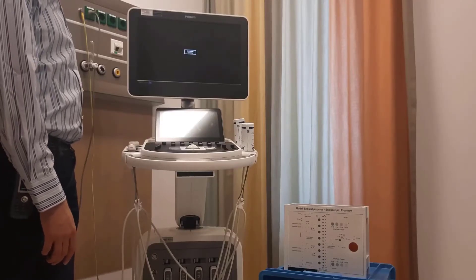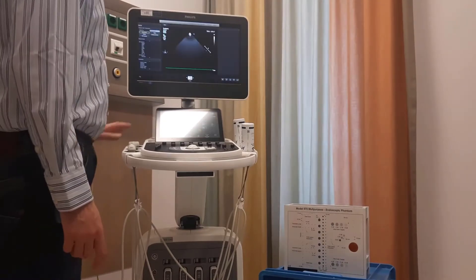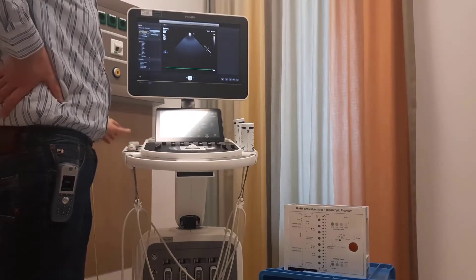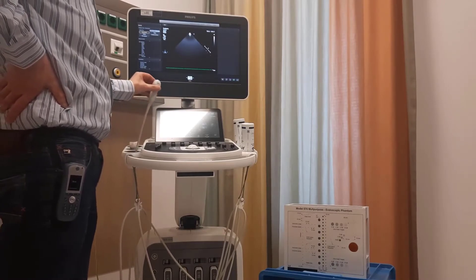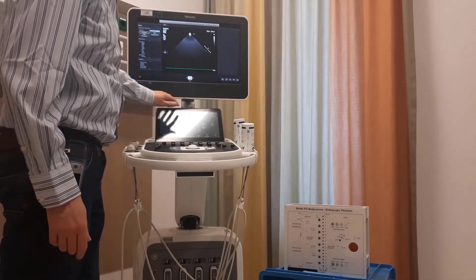He starts by booting up the ultrasonic machine. This is an ultrasound for pediatric use. It has small transducers, cardiac transducers, and one convex transducer. You can select the transducers with these buttons.